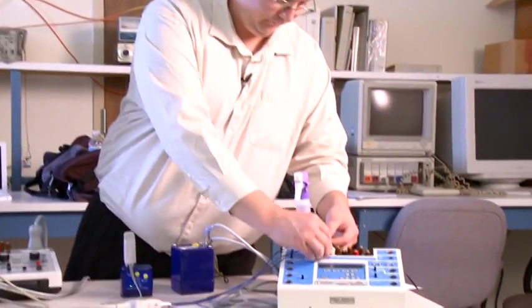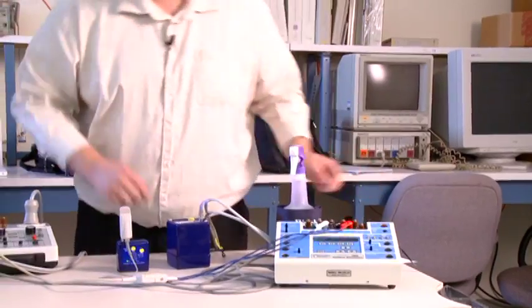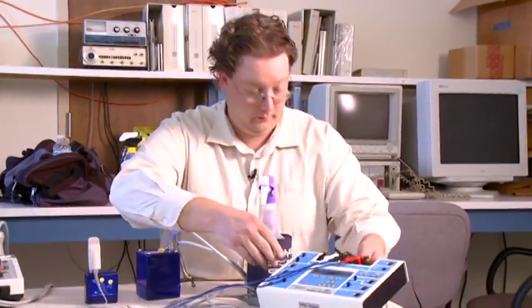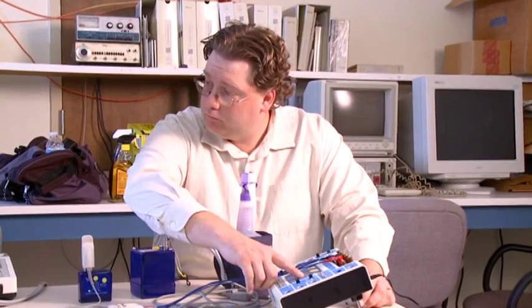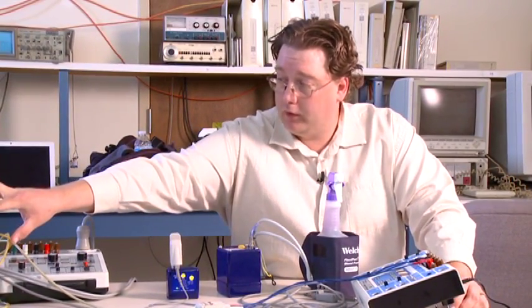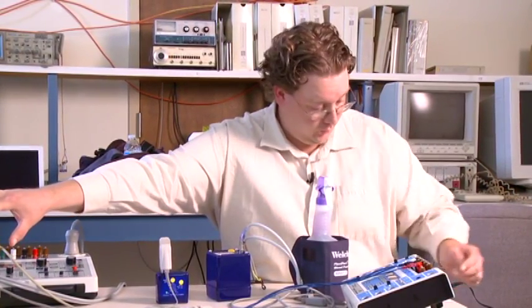And we plug them into the tester according to the color code. Now the first test we're going to be doing on here is we're going to test the heart rate, the ECG pulse. So as you can see, we're starting to get some detection over here on the unit. You can see the QRS waveform that you've studied about. And we're starting to get a pickup here. We're sitting at 60 beats per minute. Joby, if you could record that.